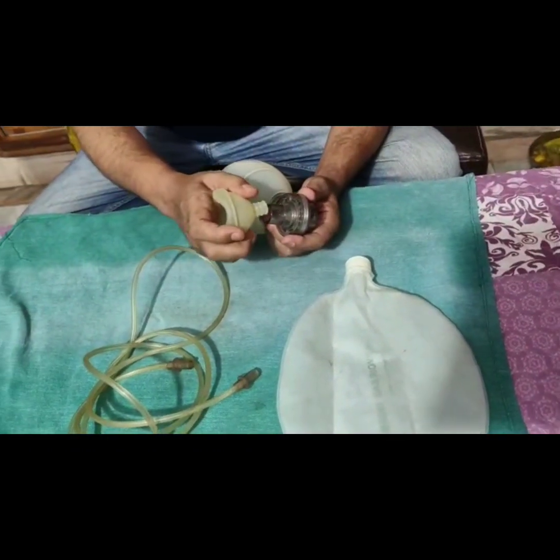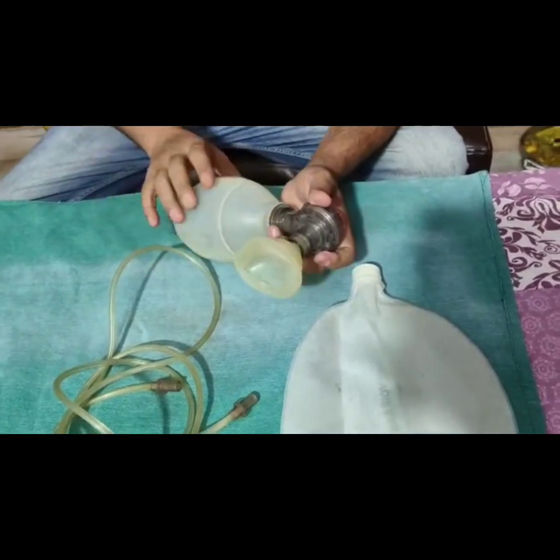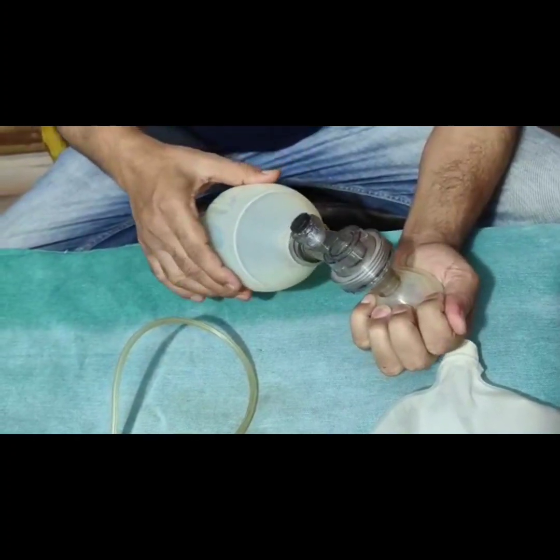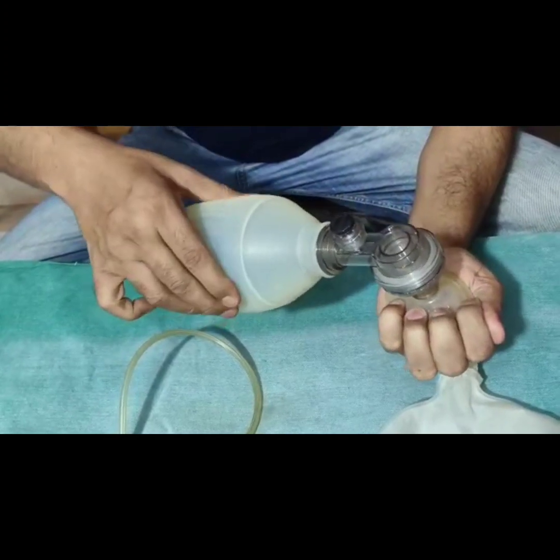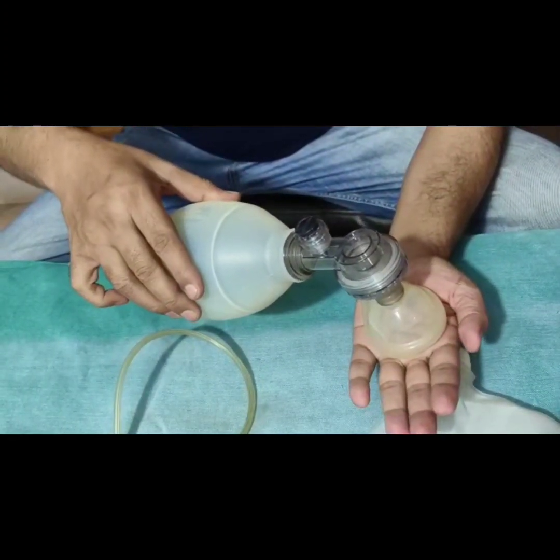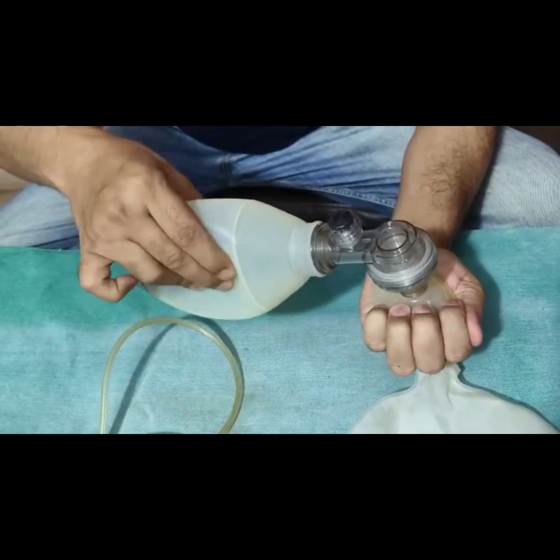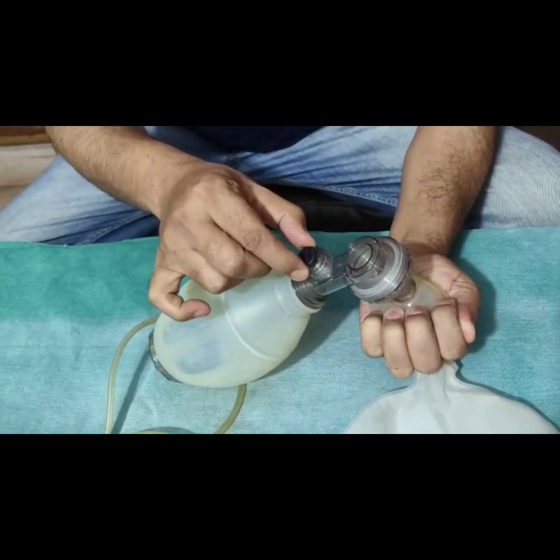How do we know whether the Ambu Bag is working properly or not? We need to press it on the palm and feel the pressure when we squeeze the Ambu Bag. I can feel the pressure being transmitted to the palm, and at the same time there is release of this pop-up valve.